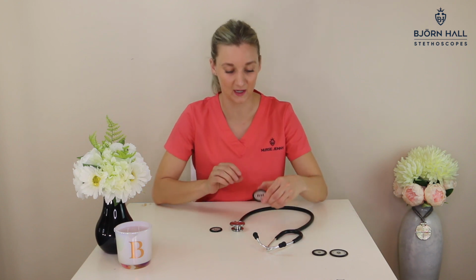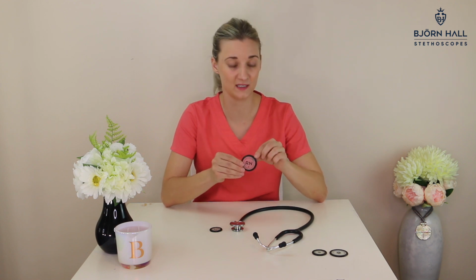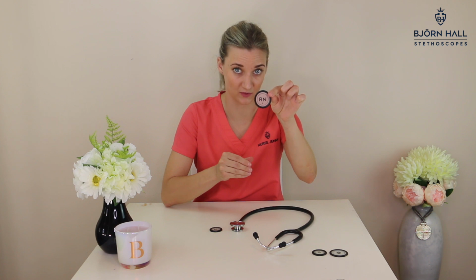So step 2 is putting the diaphragms on your stethoscope. And you can face the diaphragm whichever way you want, but a little pro tip from me is if you face the diaphragm this way, so the sign away from the tubing, when you put your stethoscope around your neck, it'll be facing the right way around. But like I said, you can have it whichever way you want.